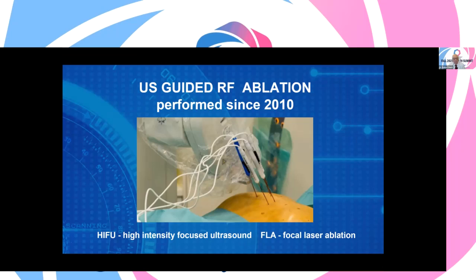This has been done with high intensity focused ultrasound, which we started off 30 years ago. And now we are using focal laser ablation in addition to this. People can freeze this also. There are many ways to kill tumors, but this simply happens to show image-guided radiofrequency ablation of a benign fatty tumor. Next, please.